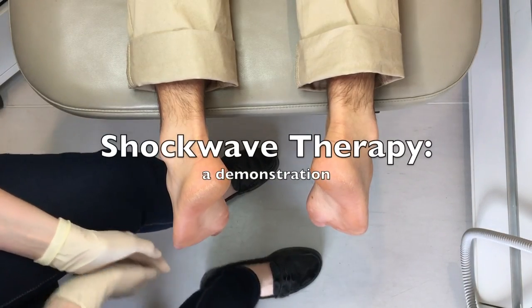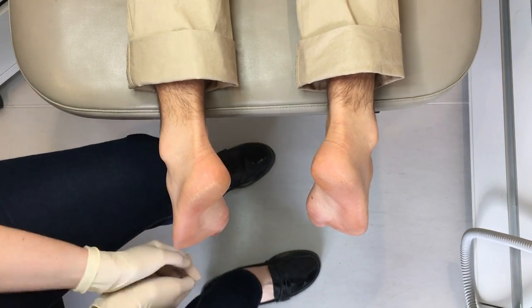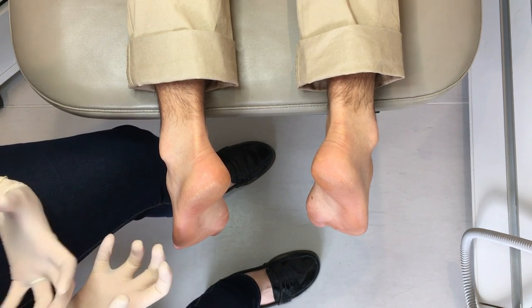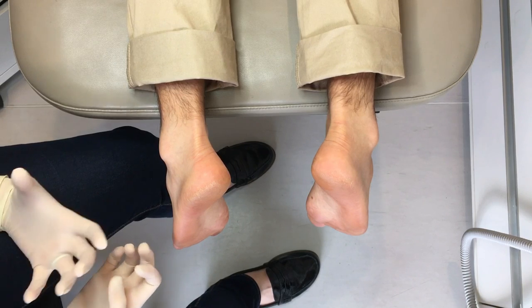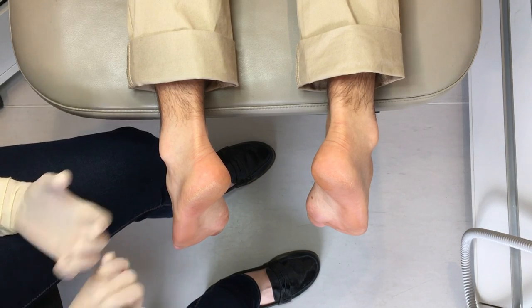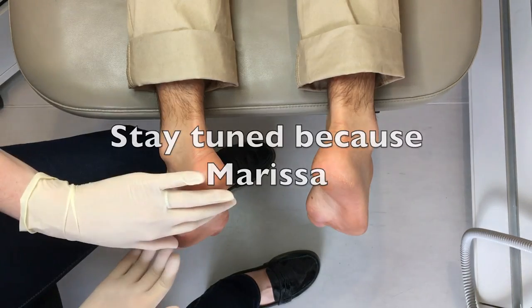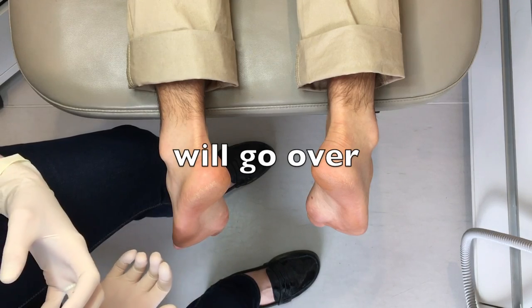We're here today to talk about and demonstrate shockwave therapy. Shockwave therapy is a treatment we have available at the clinic and we use it a fair bit when it's appropriate for treatment of soft tissue conditions and tendinopathies. We tend to use it a fair bit for heel pain or plantar fasciitis.